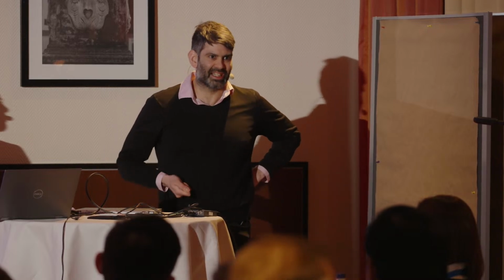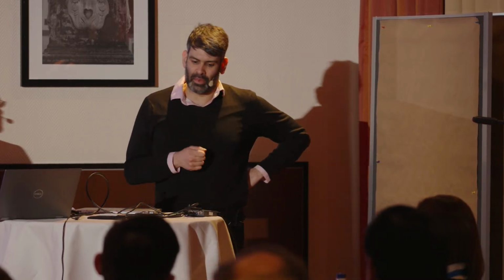What I will say, where I have occasionally been caught out before, is by trying to push it too hard through very focal, heavily calcified stenosis. And it's happened to me twice. The first time, I pushed trying to get the IVUS catheter through a really, really tight lesion, and I pushed too hard. As soon as it went through, I felt something was wrong, did an angio, and I'd actually managed to embolize a small piece of that plaque by essentially dotarizing it down. So now I have a bit more of a feel, with experience, of how hard to push.